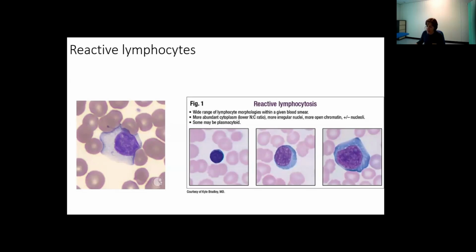The reason it's called that is because when you look at it down the microscope, the lymphocytes can look pretty wild. The key is that quite often the cytoplasm is abutting the edge of the red cells and is scalloping around them. This is often what we see in patients that have got nasty viral infections. But this is a normal reactive lymphocyte.